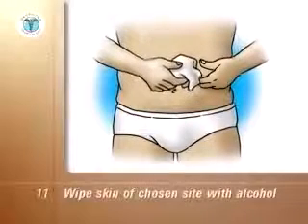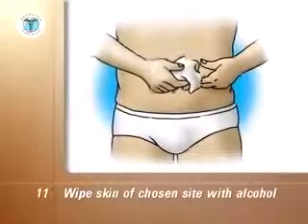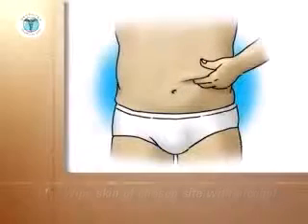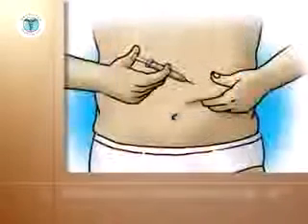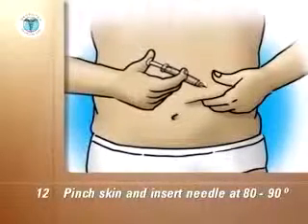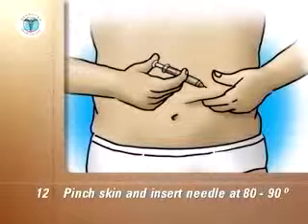Wipe the skin of the chosen injection site with an alcohol swab and let the skin dry. Pinch up the skin and put the needle fully through the skin at an 80 to 90 degree angle and push the plunger down completely.